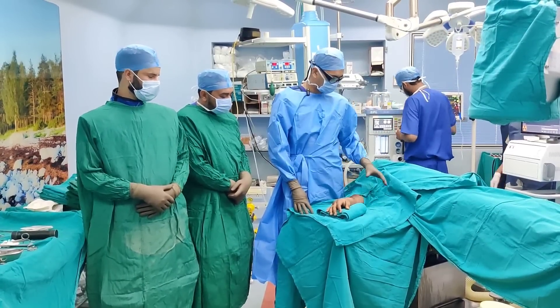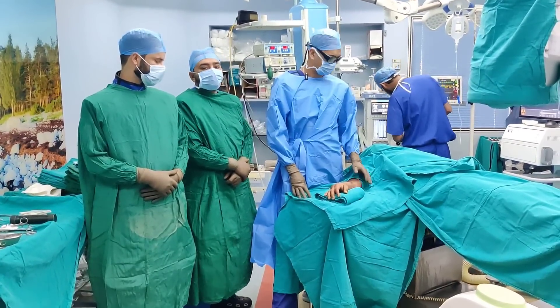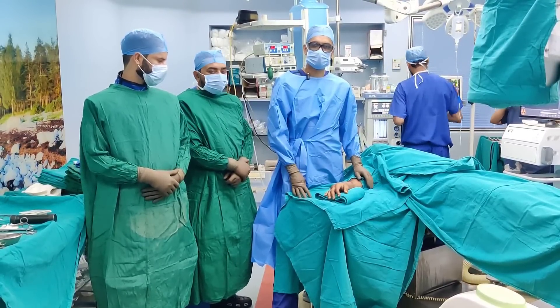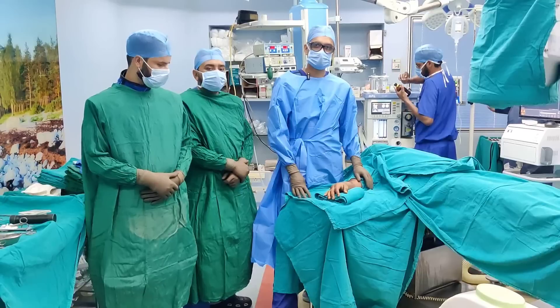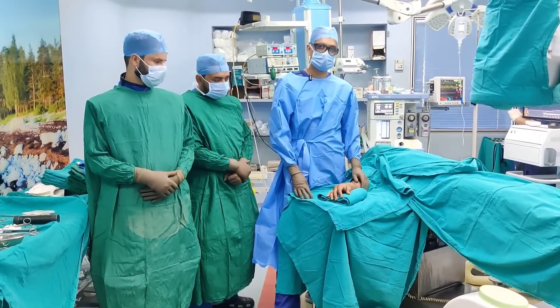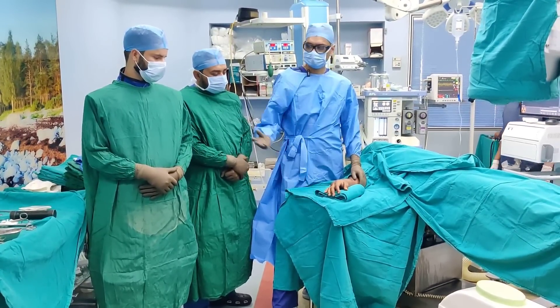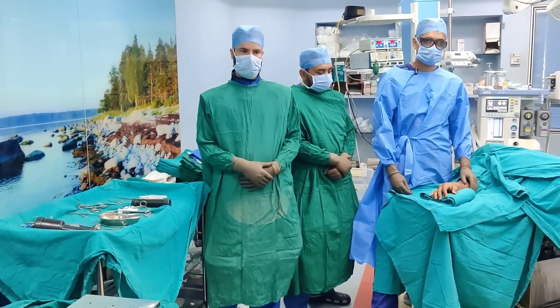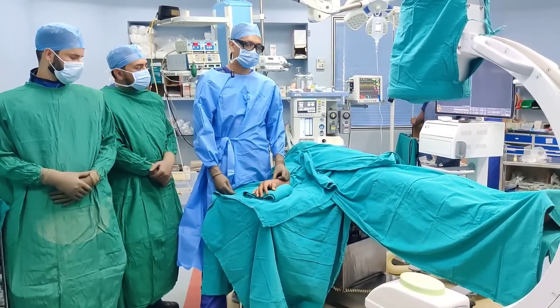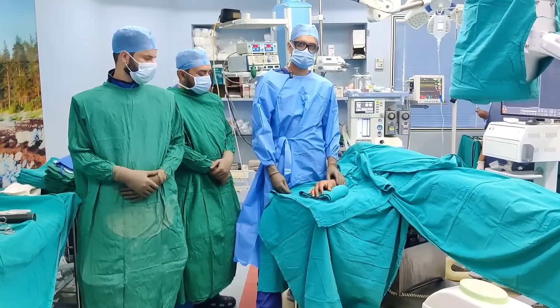This is our theatre setup. The patient is supine on a hand table. Most of the time the dislocation will reduce closed — you rarely have to open it. I have applied a tourniquet but I am not inflating it; I will inflate it just in case on the rare occasion you need to open up. I have angled the table, which gives more working space. Our trolley will be on the same side — on my right. The C-arm comes straight in and out so you can get good images, and the C-arm screen is right in front for unimpeded access.